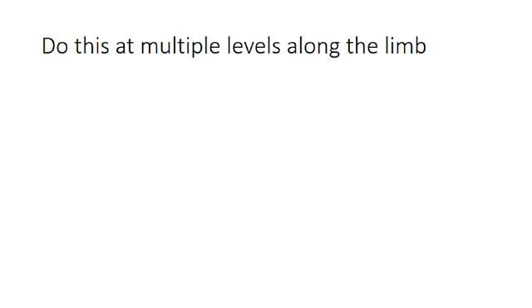Having said that, I don't routinely flip over from the transverse to the longitudinal axis except at the saphenofemoral junction and the popliteal; I often don't do that in the mid thigh and the lower thigh. I just look for compressibility in the mid thigh and the lower thigh.